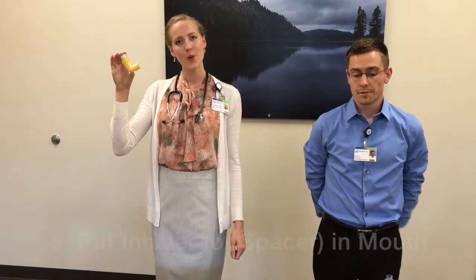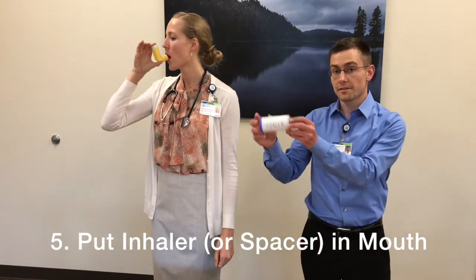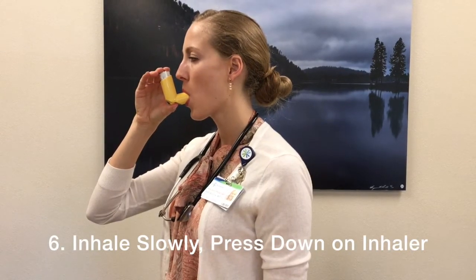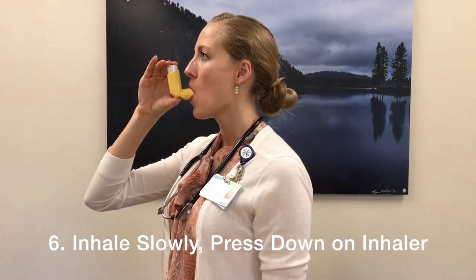Next, you are going to exhale all the way. Then, put the inhaler, or spacer, into your mouth. Start inhaling slowly, then press down on the inhaler and continue inhaling for three to five seconds.